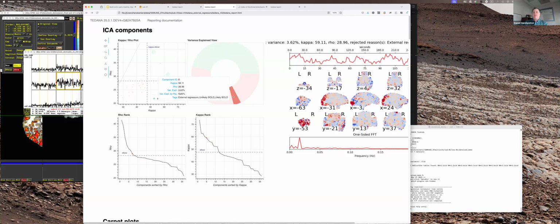So if you're playing with external regressors, I strongly recommend looking a bit more carefully at the things that change, and tweak these. Ideally tweak the parameters. So maybe right now we're saying keep if it fits your task more than r squared equals 0.5. Maybe I should have tweaked this and said, if it's 20% task, you should have kept. So that's just one example of what to do there.